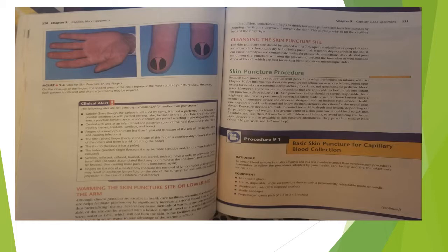Skin puncture devices should be sterile, disposable for a single use, and have a permanently retractable safety blade or needle. Some lancets have a needle-type puncture device and others are designed with an incision device. Healthcare workers should understand and follow the manufacturer's direction for the use of each device.